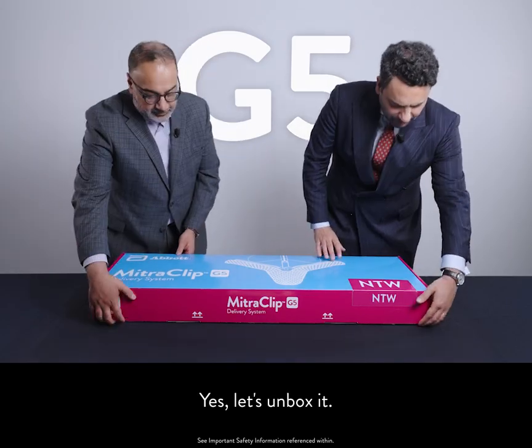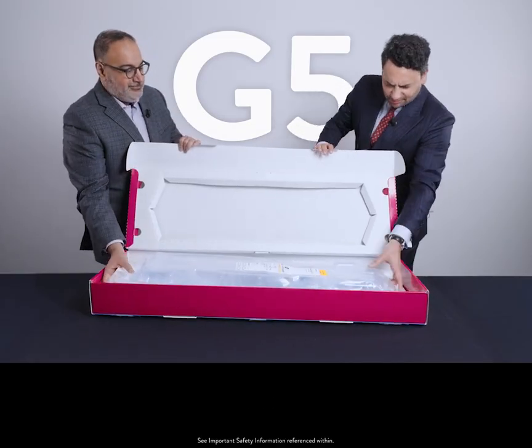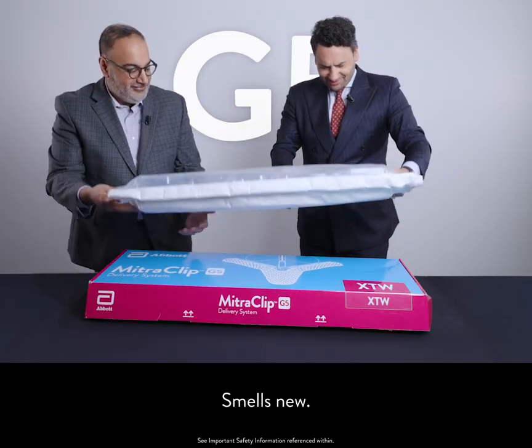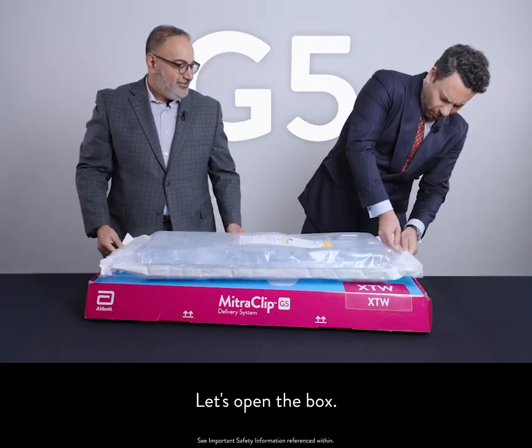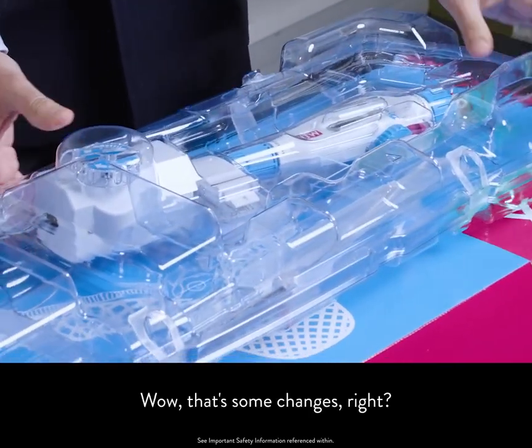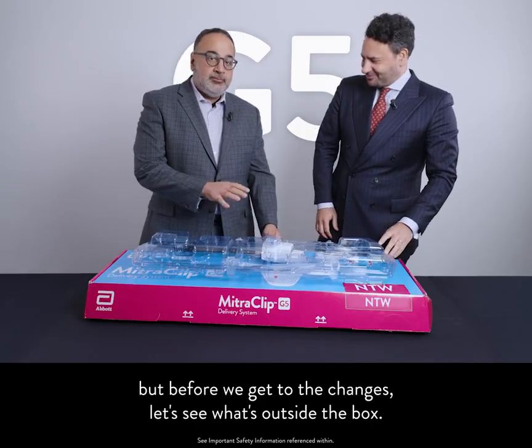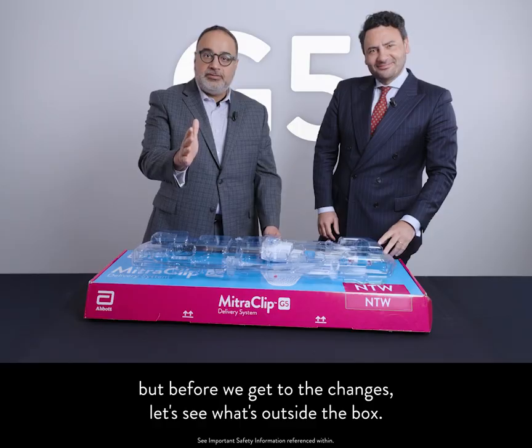Shall we open? Let's unbox it. Let's open the box. That's some changes, right? It's different — a lot of great changes. But before we get to the changes, let's see what's outside the box.